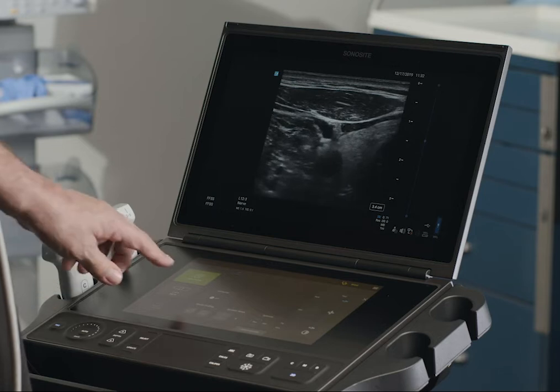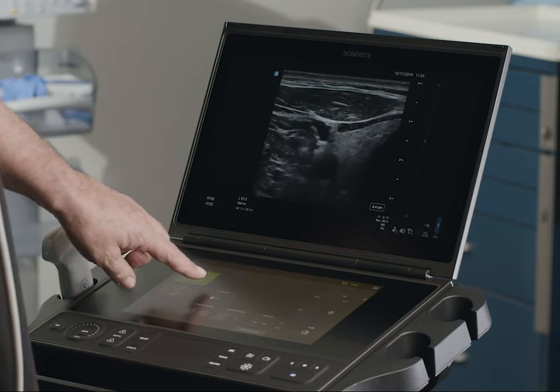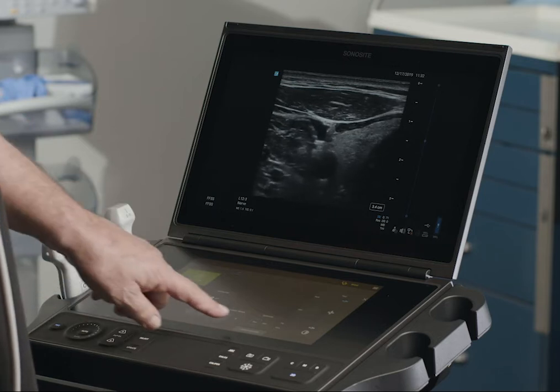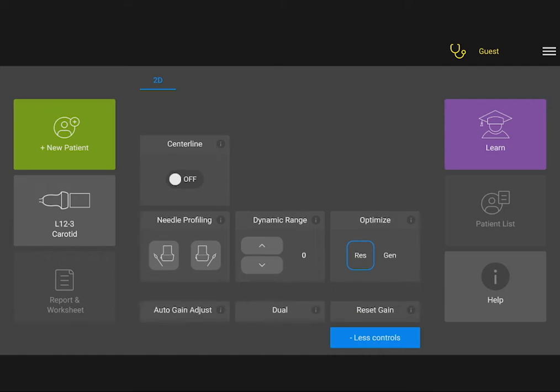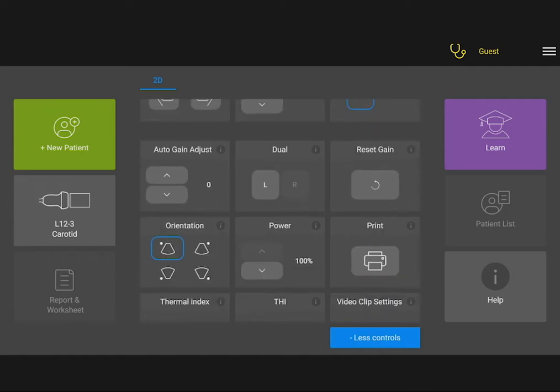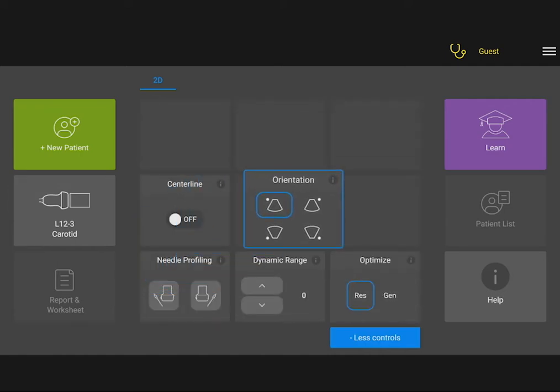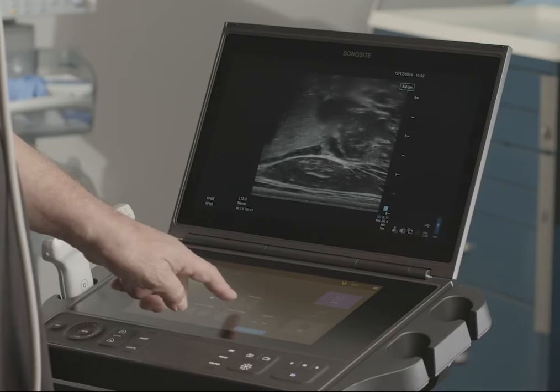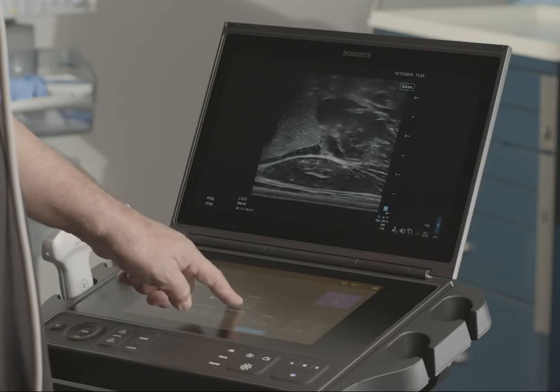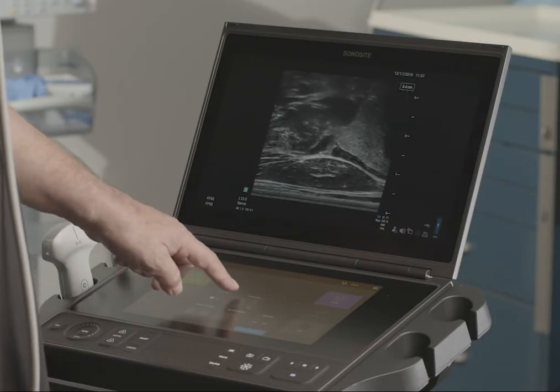Many of the system's image controls are available using the Touch Panel. You can view more controls and even optimize the placement of the controls to suit your needs. Tap the icons on the Orientation Control to adjust where your image is on the screen.